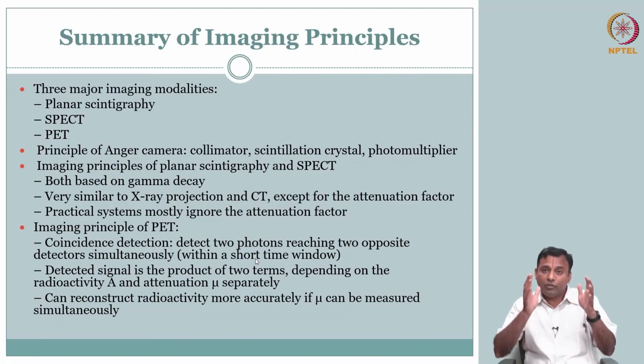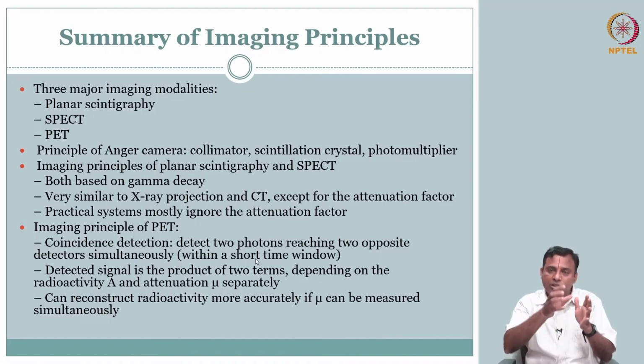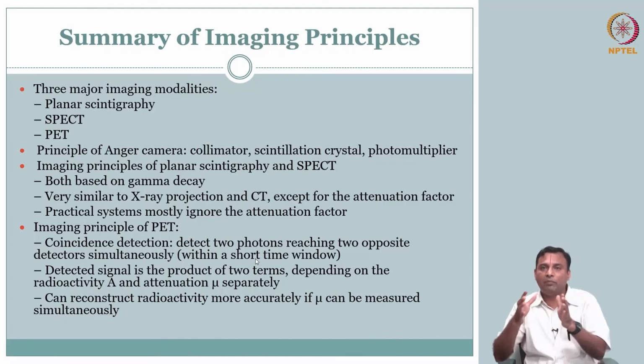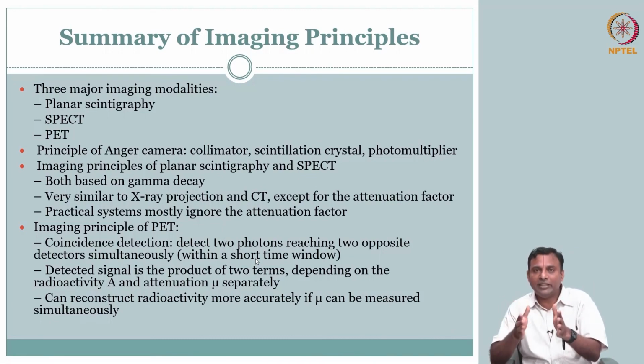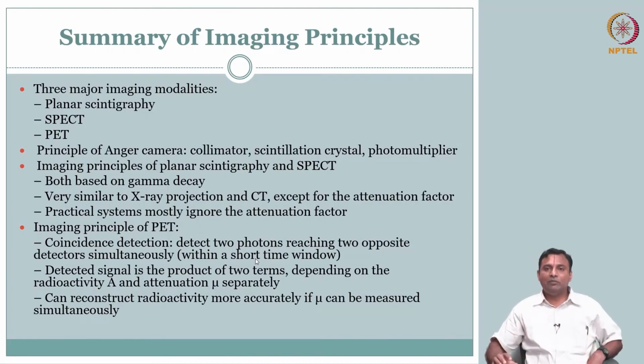Otherwise, this line of thinking about talking about physics, capturing the instrumentation to engineer that physics for an application, then your imaging equation and then your image quality is very similar. Okay. Let us stop here.